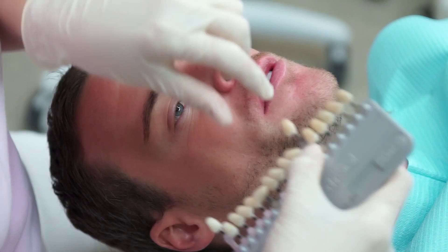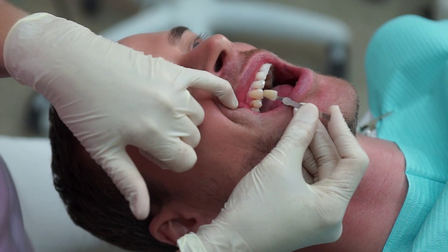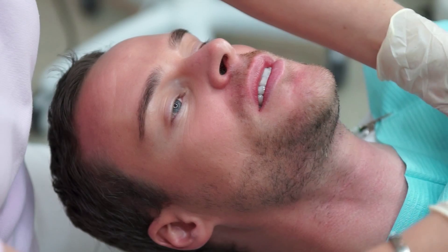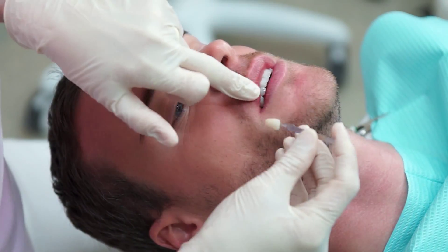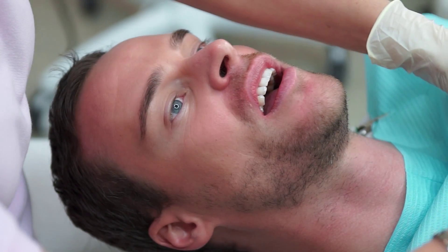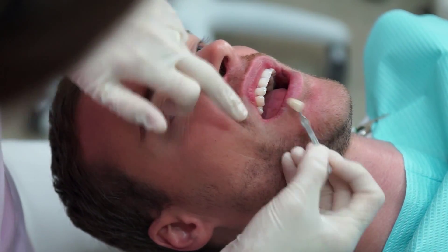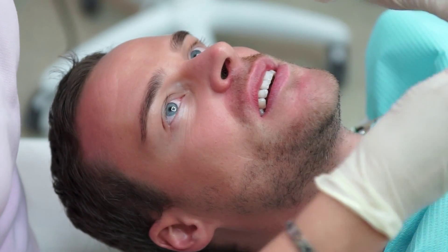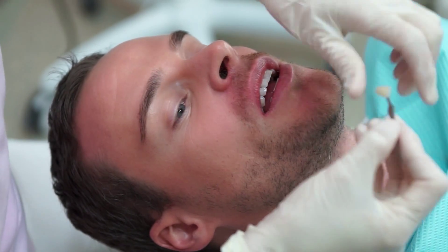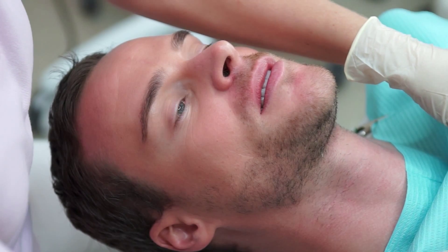The color shade is of course compared before starting and after the procedure is done. The younger the patient and the more intact the enamel, the more desired results you can achieve. With age, going from 45, 55, to 65 years old, the enamel may be quite thin and the whitening procedure may not give the desired results. Having a good whitening procedure means having quite healthy enamel on your teeth from the beginning, even though it may be yellow.